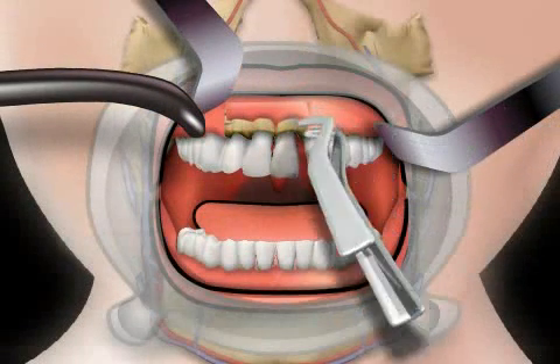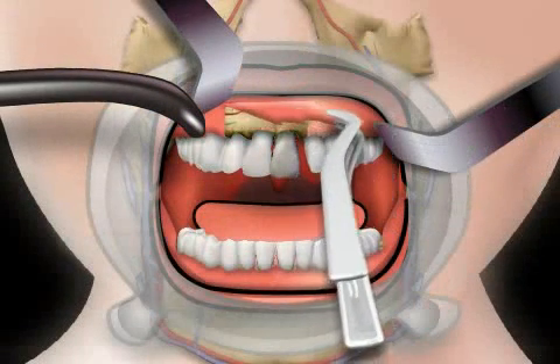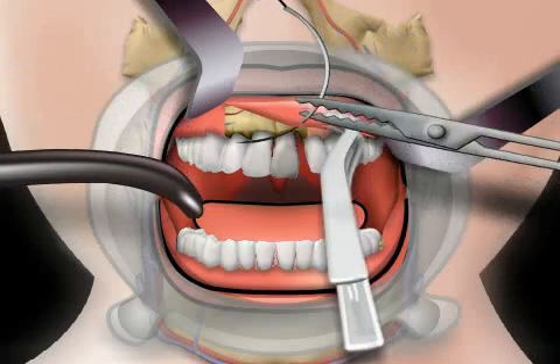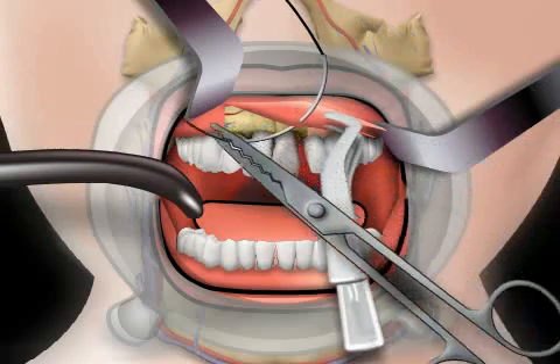In the video, the gums were folded to the side, forming a mucosa flap, and a cyst was removed. A gum suture, that is to say a papilla suture, will now be performed.